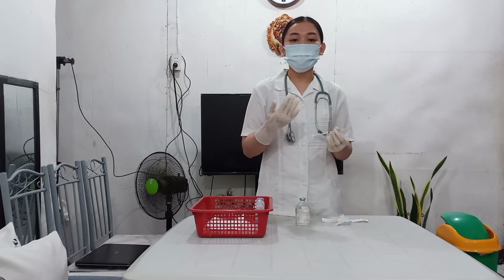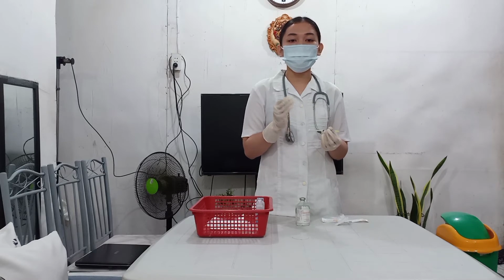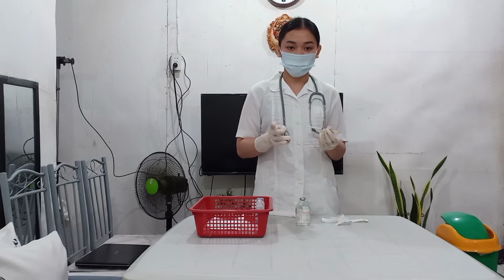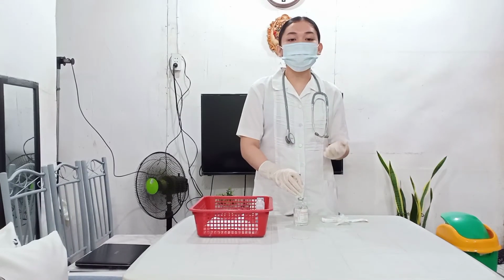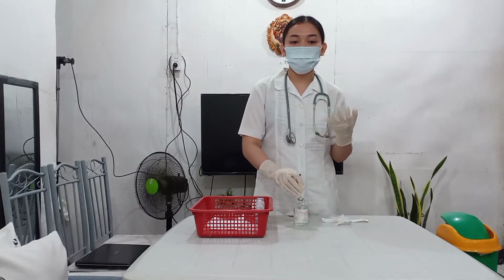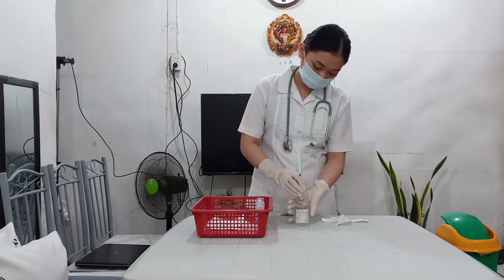After which, I will carefully insert the needle into the upright vial through the center of the rubber cap, maintaining the sterility of the needle. Air bubbled through the solution could result in withdrawal of an inaccurate amount of medication. Next I am going to inject the air into the vial, keeping the bevel of the needle above the surface of the medication. The air injected into the vial will allow the medicine to be withdrawn more easily.